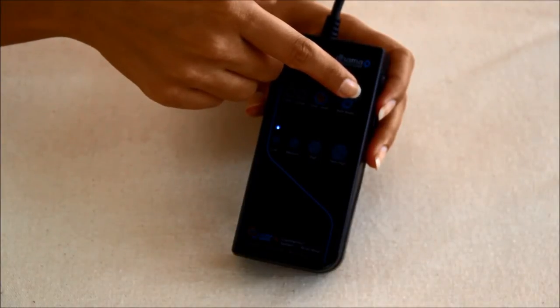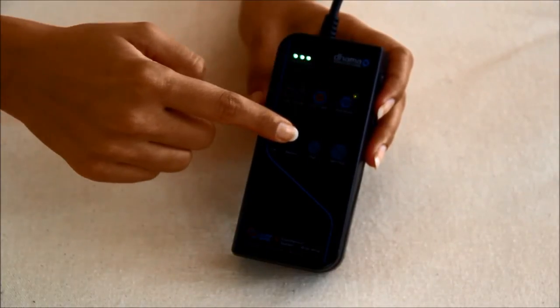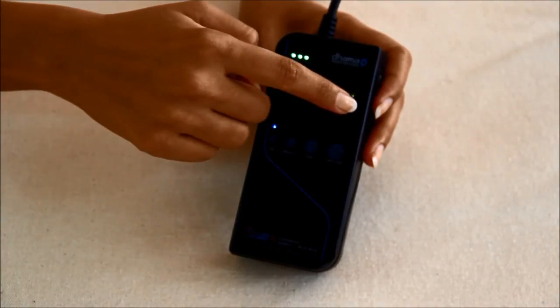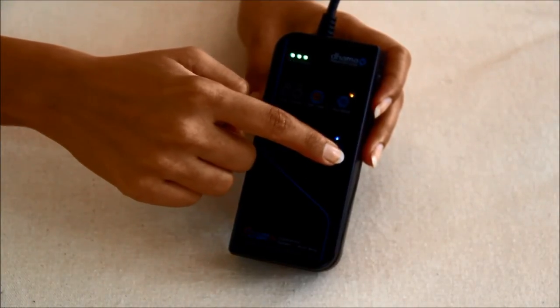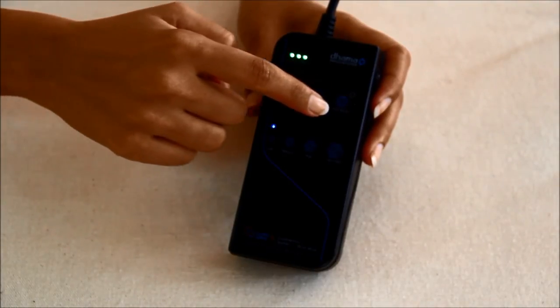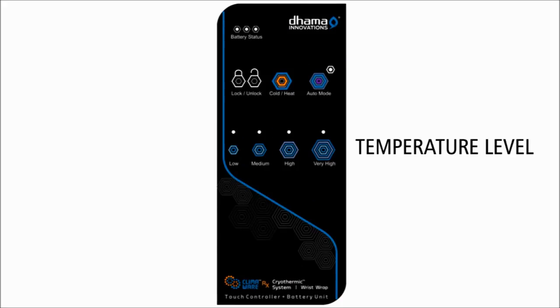Press once to select auto mode Option 1, and press again to select auto mode Option 2. After selecting the desired auto mode option, adjust the temperature level button to select the desired temperature. Press again to exit auto mode. Temperature level: the touch controller and battery unit offers four adjustable levels of cooling, heating, and contrast therapy.